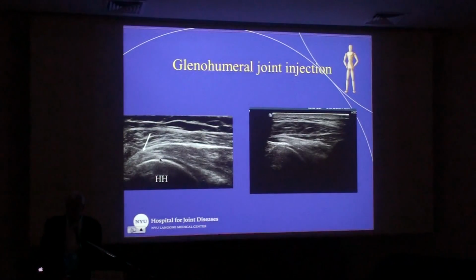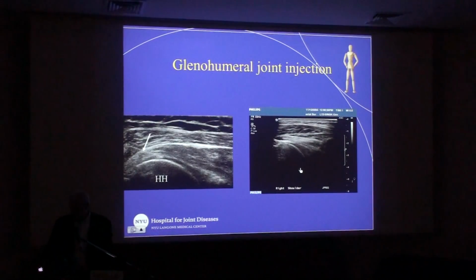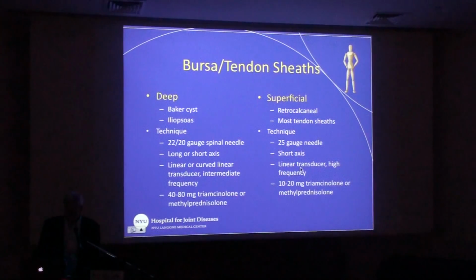What this would look like in ultrasound is you see the needle coming in below the posterior capsule, right over the articular cartilage. And if this works, hopefully it will, you'll see distension of the dorsal recess, and you see these low-level echoes going in as we're getting that contrast effect, so the material is flowing away from the needle tip. Usually I do this with a 1.5 inch 25 gauge needle in most patients, so it's fairly simple to do.